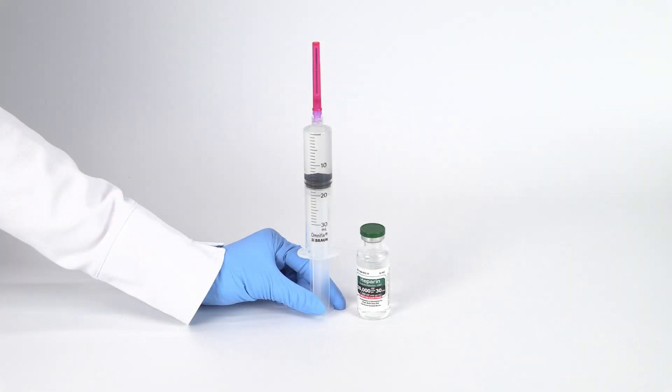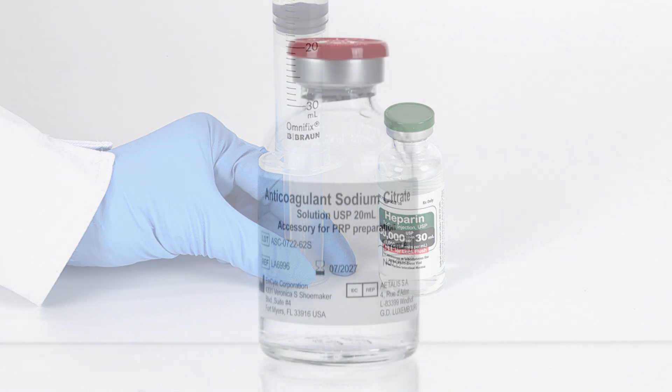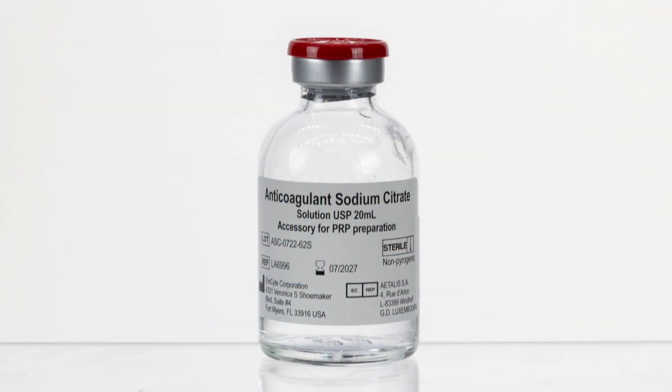First, we will begin with priming the bone marrow needle and filter. Use heparin solution 1000 units per milliliter as the anticoagulant of choice. You may also use citrate anticoagulant if heparin is not available.